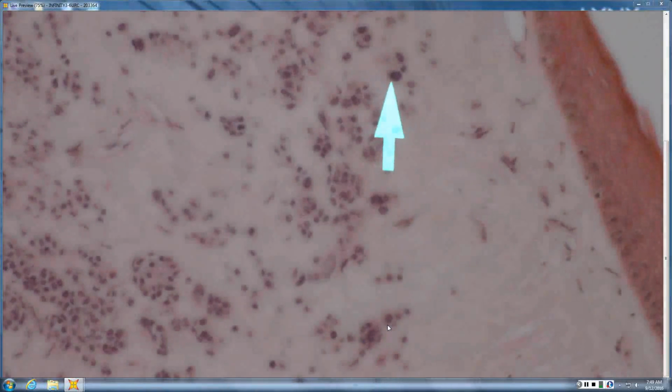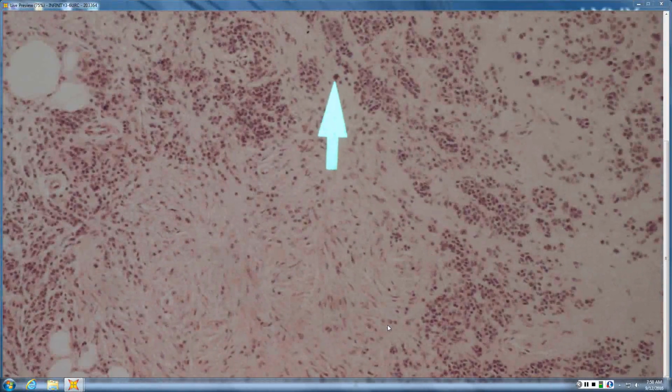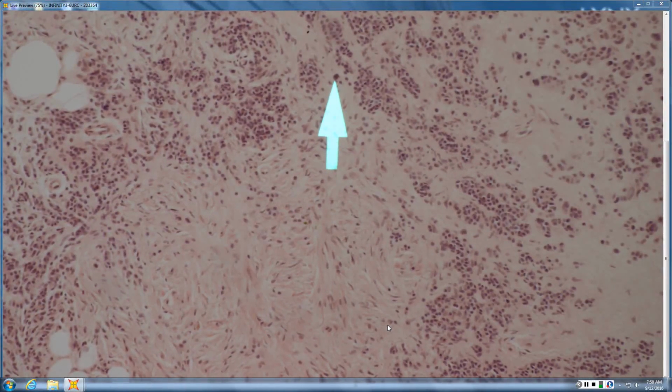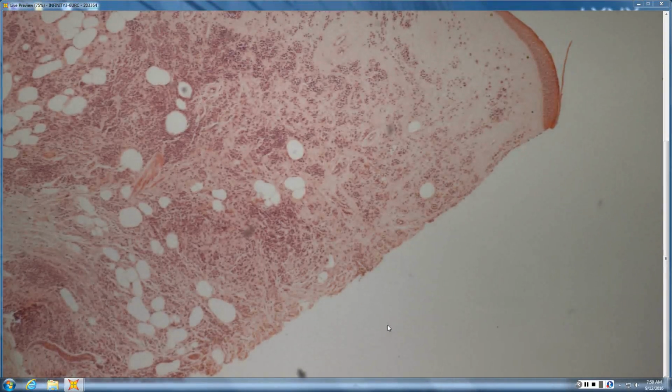I see some large hyperchromatic cells. What does that mean in a neural crest lesion? Not much. Not much is the answer. So in smooth muscle lesions like symplastic leiomyomas, and in neural crest lesions like neurofibromas and melanocytic lesions, atypia by itself in the absence of mitosis and an expansile growth pattern means nothing. Malignant lesions are usually hypercellular, push things out of the way, have mitoses. Benign things commonly get ancient atypia if they're neural crest or smooth muscle, but it doesn't mean anything. So overall, probably just congenital nevus.